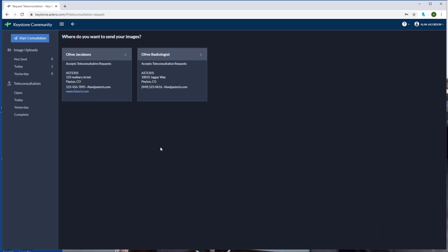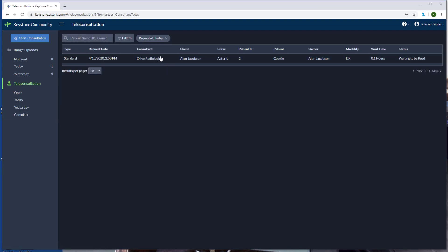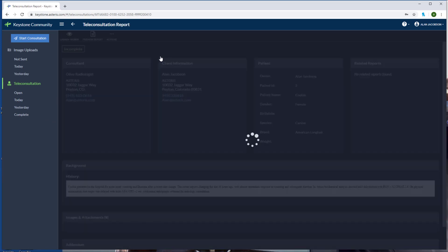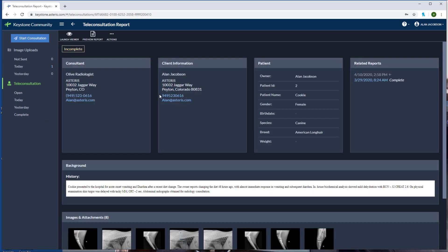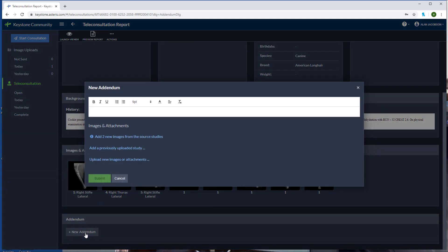Now to check the status of the report, click on today under the teleconsultation tab. You can see now that a report is pending review from our desired radiology group. If you'd like to add an addendum, click on the report and scroll to the bottom and click new addendum. You can add in any additional information to send to the specialist.